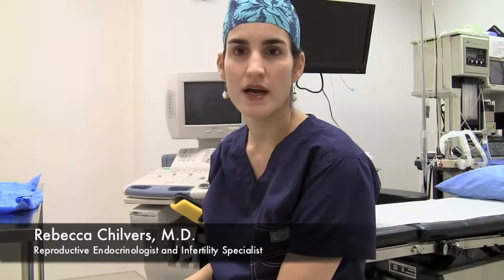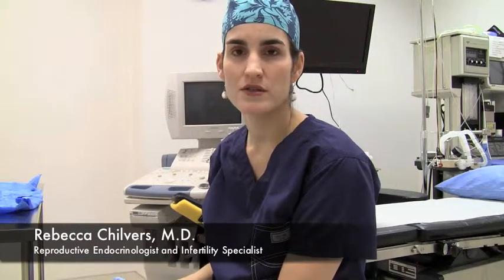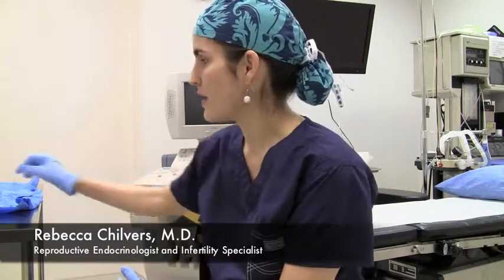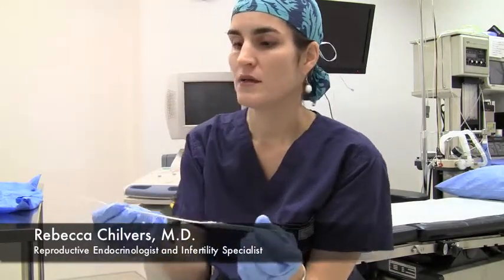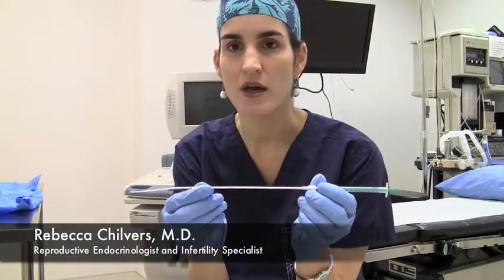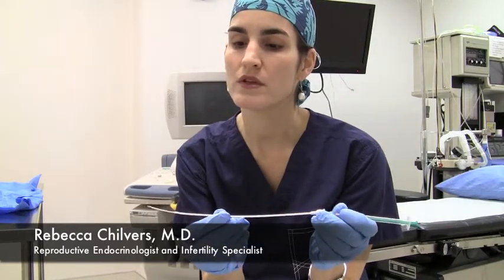I view the embryo transfer while I'm performing it on ultrasound. Ultrasound guidance is utilized during the procedure, and this, as well as the markings on the specialized catheter, will guide me in placement of the embryos in the appropriate location within the uterine cavity.